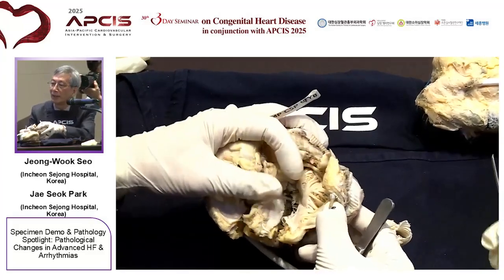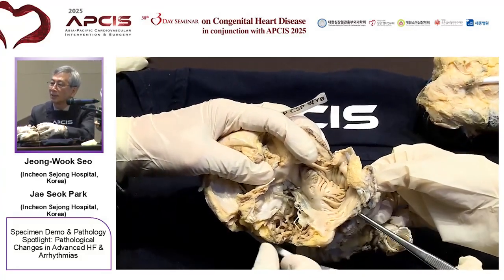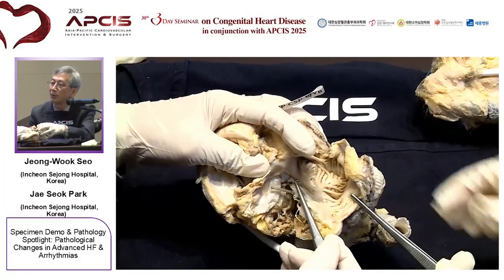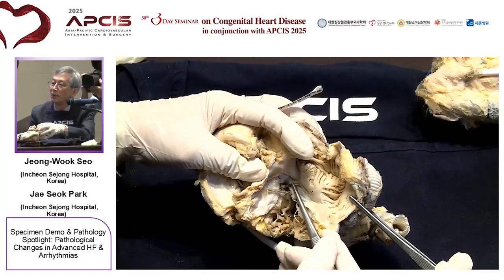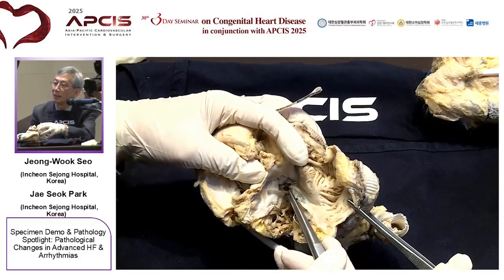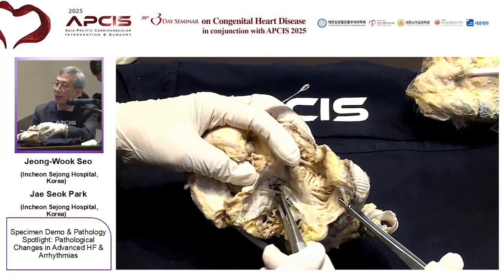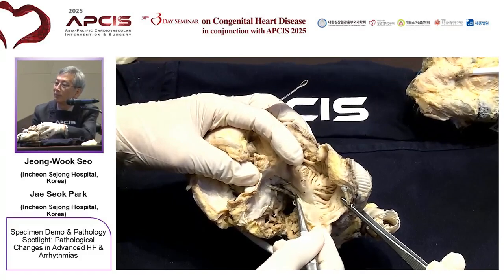On the tricuspid valve, we have two electronic leads. One is perpendicular to the right ventricular septum, which is the conduction system pacing lead, and the longitudinal lead to the right ventricular apex is the ICD lead placed in the right ventricle.